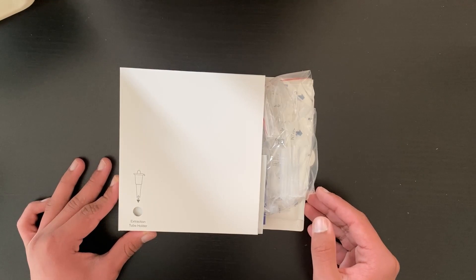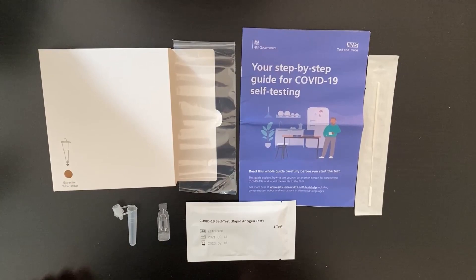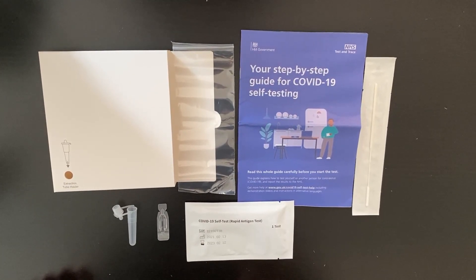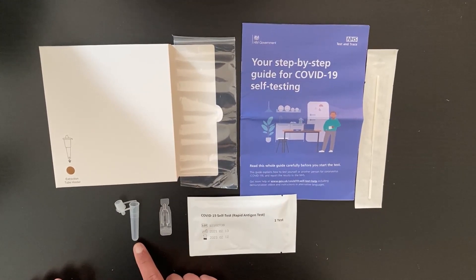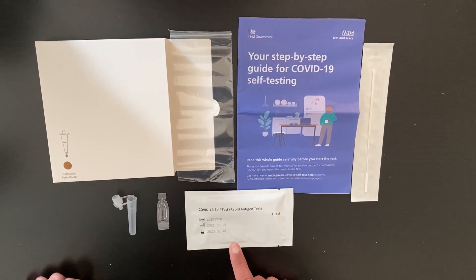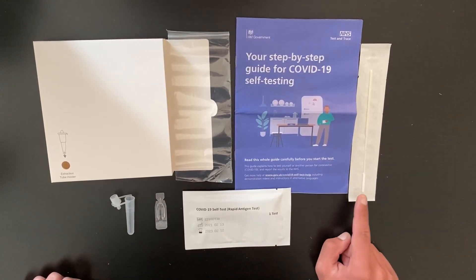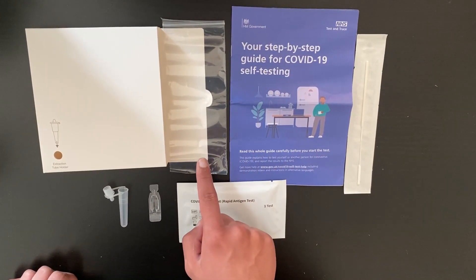This kit contains seven tests, however you only need to use one at a time. Each kit contains seven of these: the extraction tube holder, the extraction tube itself, the buffer solution sachet, the test strip which is sealed, a sealed swab, a guide to show you how to take the test, and a waste plastic bag.